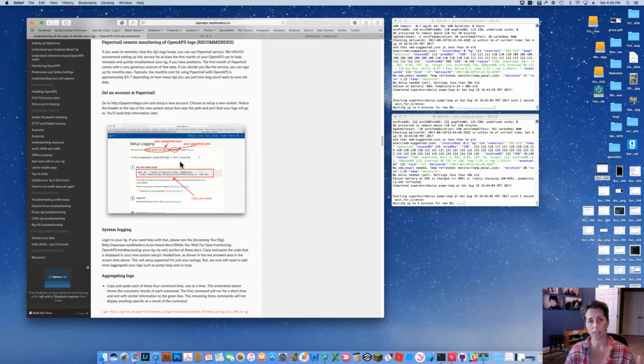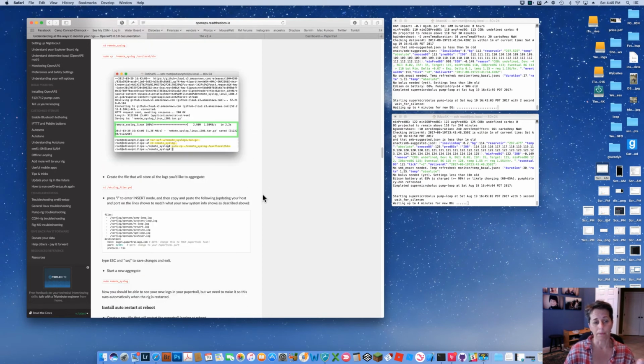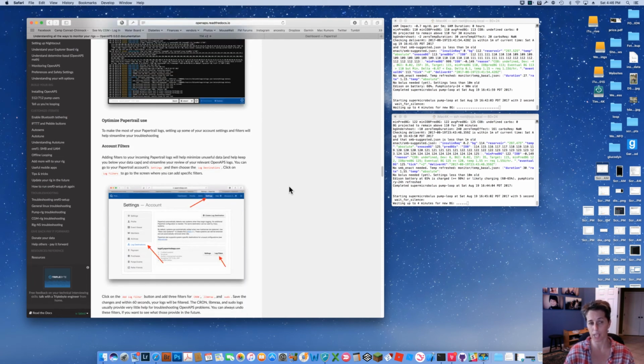Basically, Papertrail is free for the first month, costs about $5 a month after that, and it's a way of viewing the logs of what's going on in your rig without necessarily having to log in and check them on your computer. So you can set it up. It's all basically cut and paste. The instructions are all there. It's pretty simple. It takes maybe 10-15 minutes to set up Papertrail.